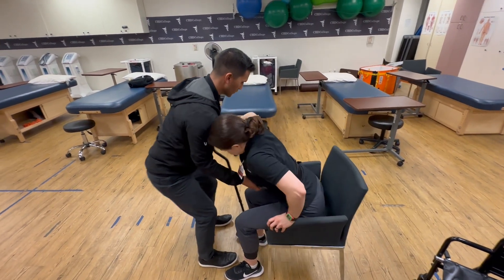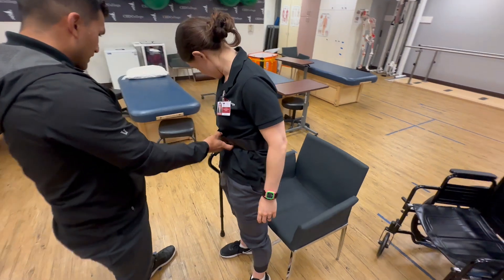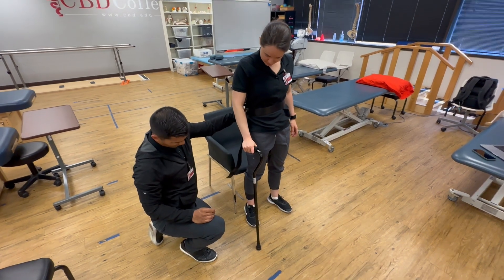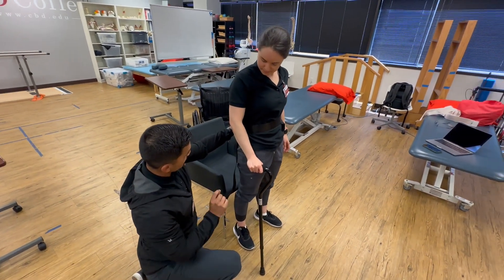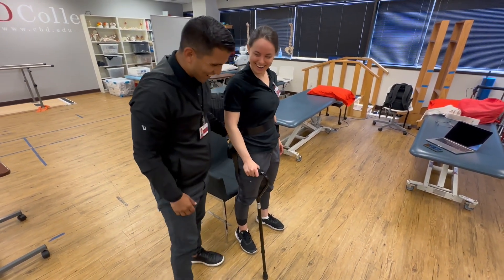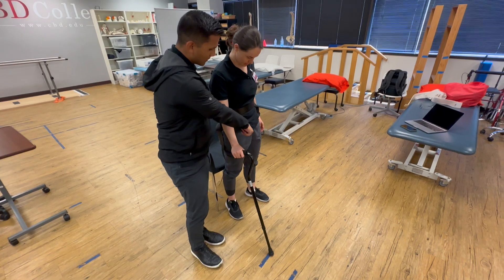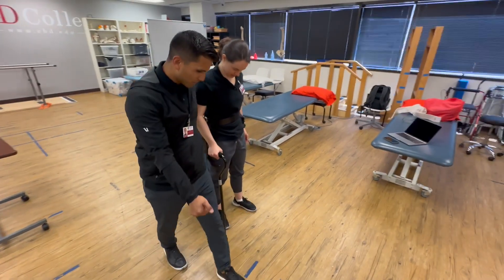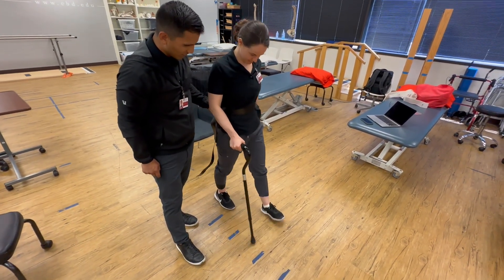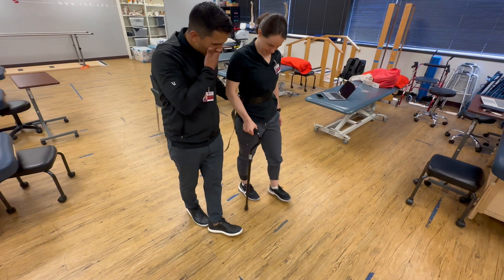In three, two, and one — push up. Good. How does the height feel? Can you bring the cane a little forward? Good. I think it needs to be a little higher — do you feel like it's a little too low? Let's have you take a step forward and figure it out. Remember what we said: we're going to walk one step forward with the cane and your opposite leg at the same time, to get a feel for the cane height.